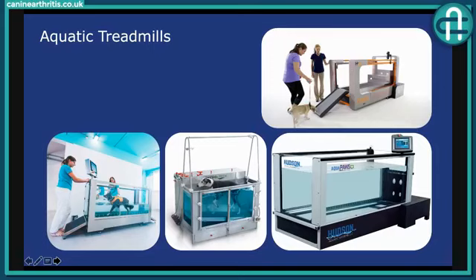We do often have a lot of patients that, as soon as you get up towards sort of mid forearm, elbow height, their feet get stuck and they don't want to move. And so being inside the treadmill is nice for them, because you can reassure them. Otherwise, if their feet are stuck and they travel towards the back door, suddenly you've got them pushed against the rear door. So that can happen, and that's why we like to be in the chamber, so we can reassure them and stop the treadmill as soon as we need to in those circumstances.